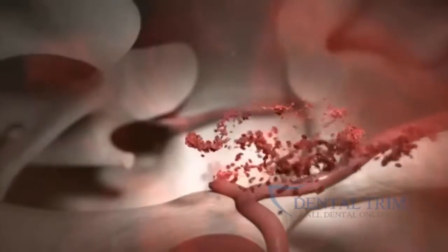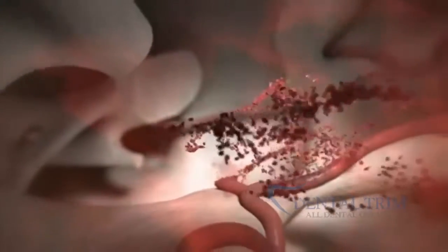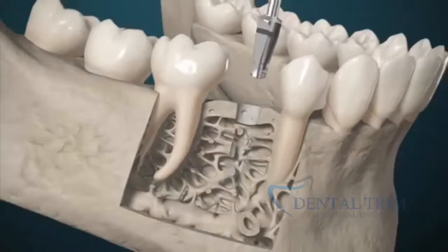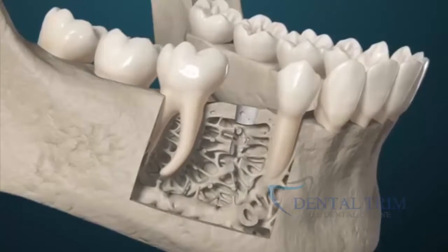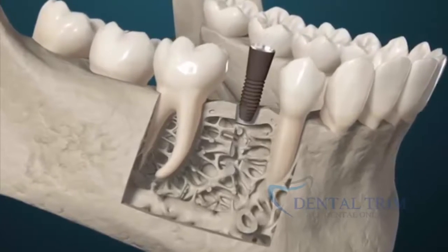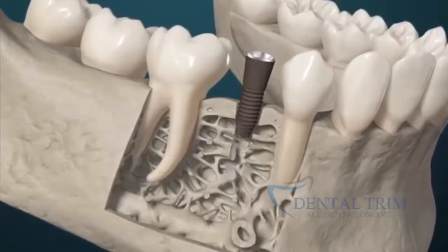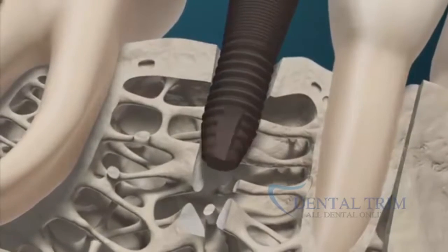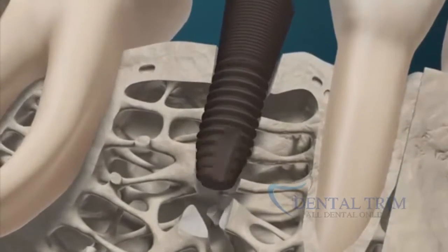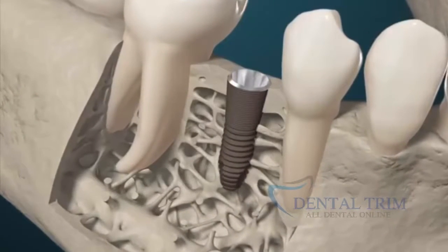Quickly filling with blood, the titanium implant is inserted where the tooth was previously lost. At first, the only force holding the implant in place is mechanical friction — this is called primary implant stability. Osseointegration, or secondary implant stability, requires a highly complex sequence of additional biodynamic processes, facilitated by finely tuned communication between the main actors of wound healing: the cells.